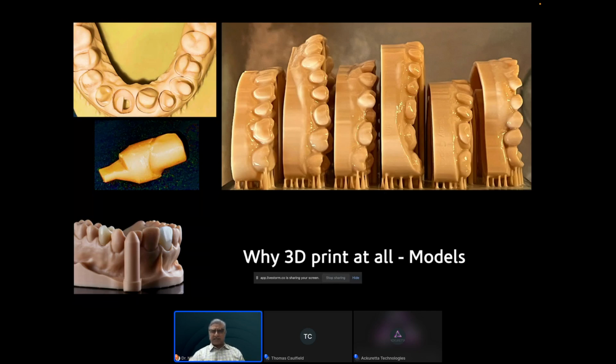There's a couple of models there that are regular study models as well. On the upper left, you see what's called a Geller model or a crown and bridge model or a die model. I do those quite often. That particular case involved removal of a large number of PFM restorations, which is why you see extensive preps. I didn't prep those teeth. I tried very hard to conserve what I had left of those teeth, actually. But that kind of printing allows me to print dies. That's very, very easy to do.